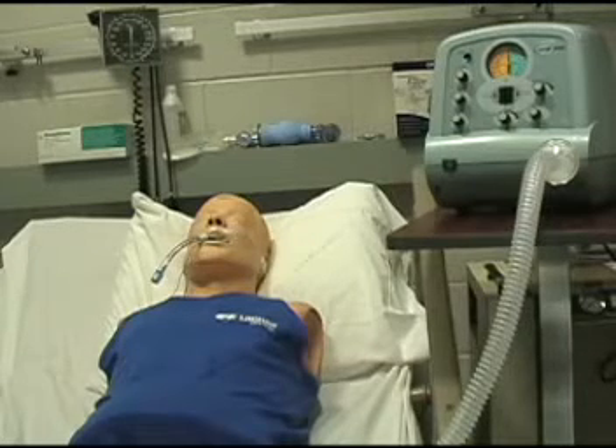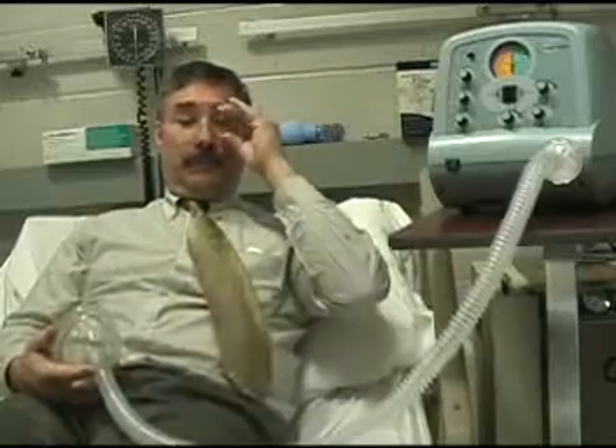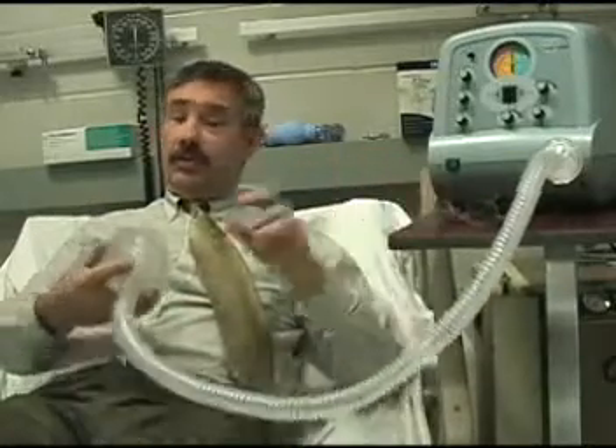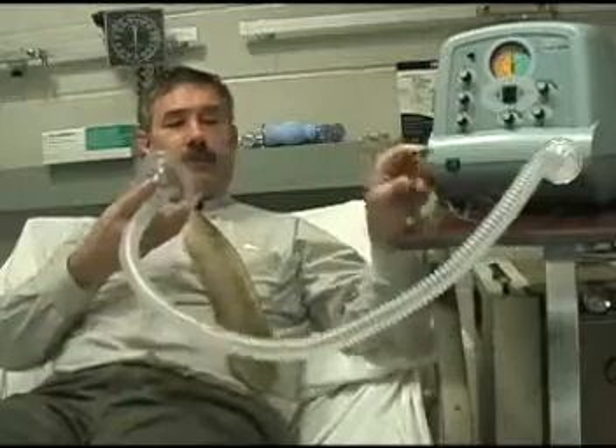We're not going to do any more with this mannequin. I'm sure you're all interested in how it really feels as a patient. When you're in the lab you're going to get to do the same thing. I'm going to show you what it's like on myself — I'm going to use the mask.